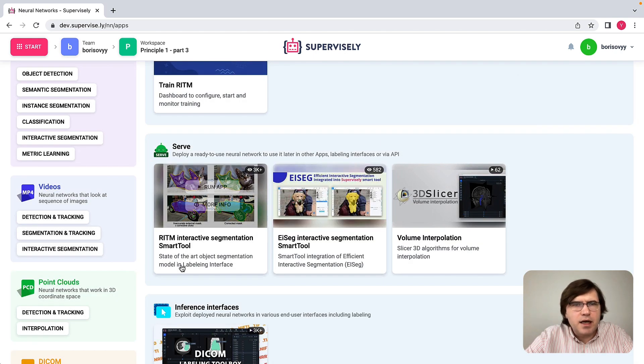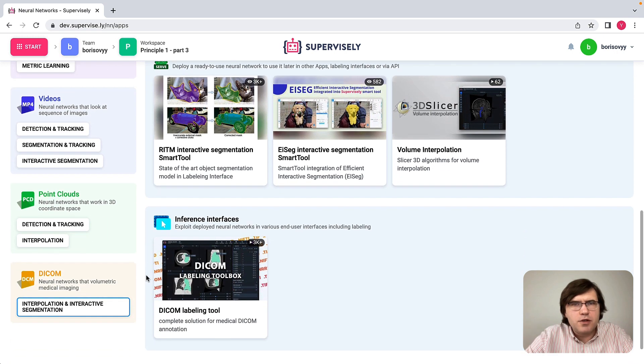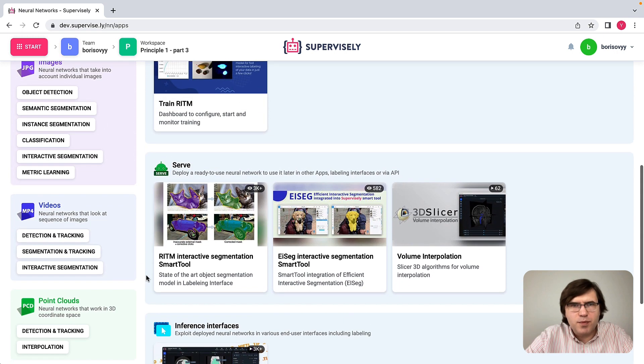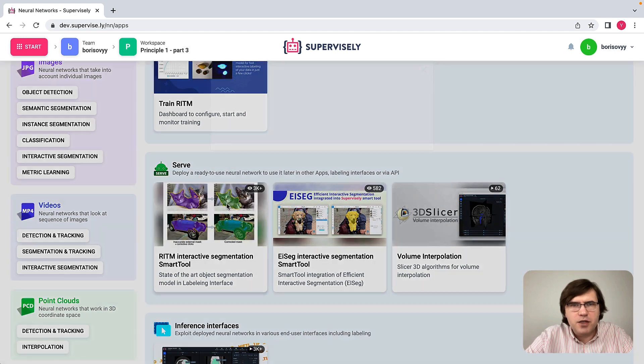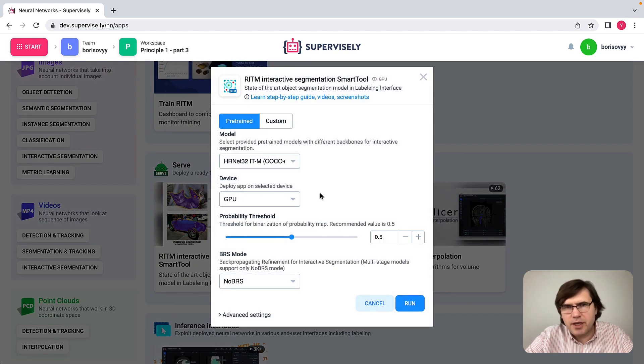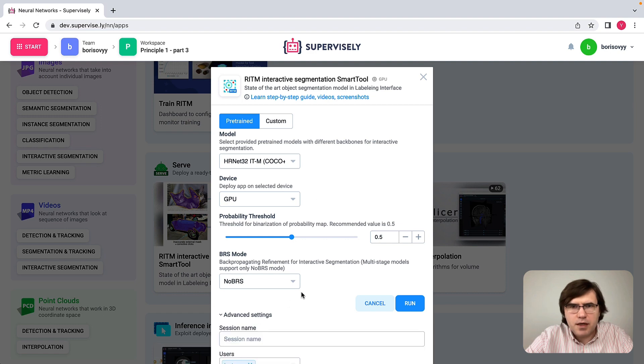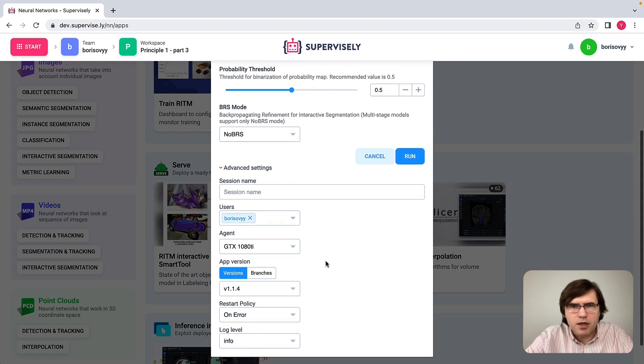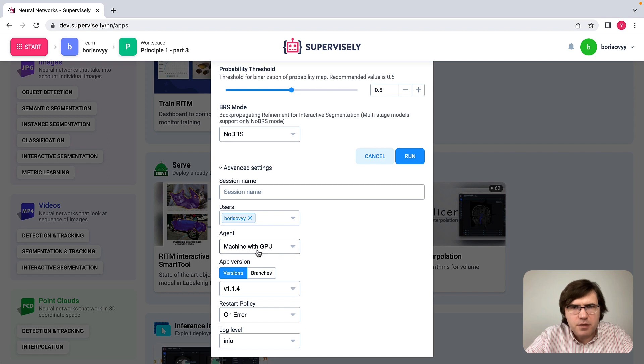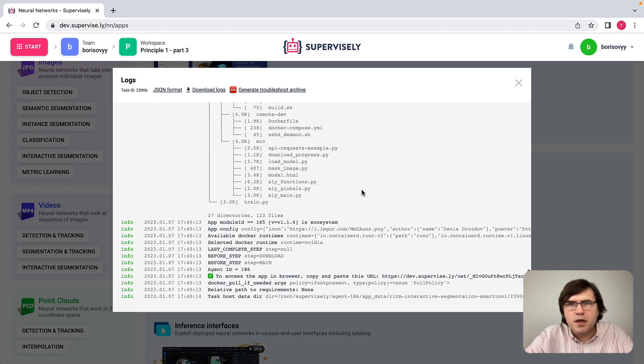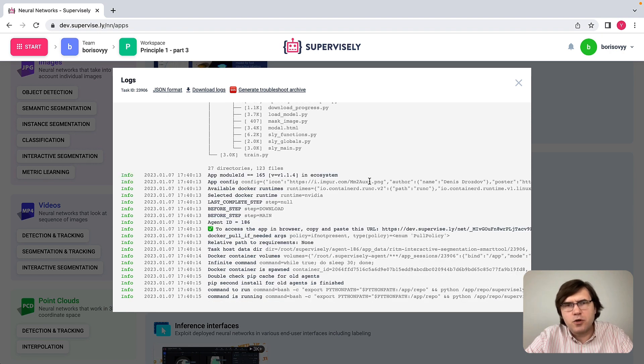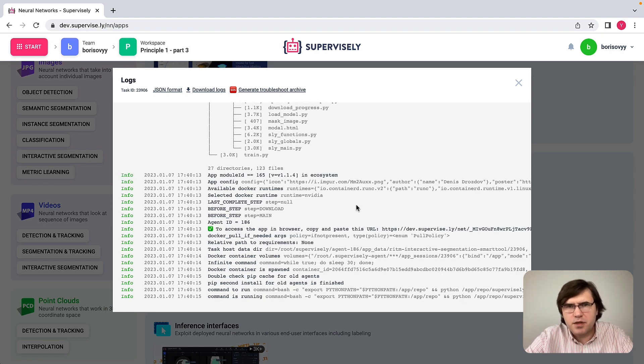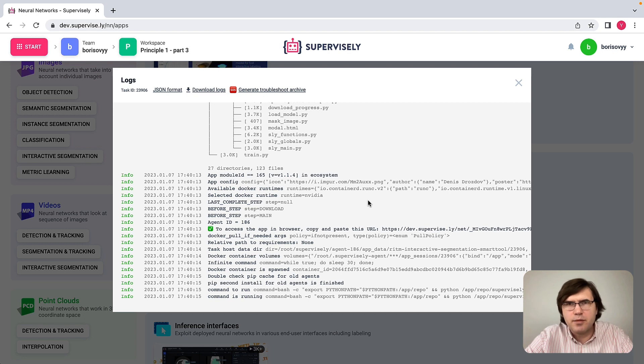Then what I would like to do is run the smart tool. We have seen it already, but it is also applicable when we label DICOM. So in this case, I will run the smart tool on this machine with GPU. Let me run it. When I run this server app, it will actually deploy this smart tool model so that I can use it in the labeling interface.